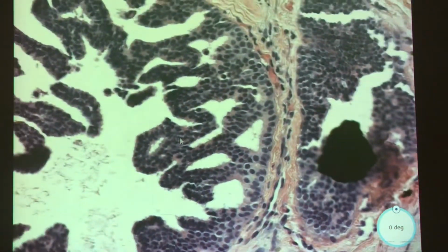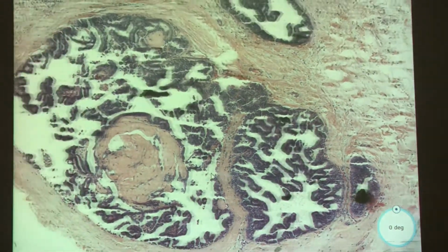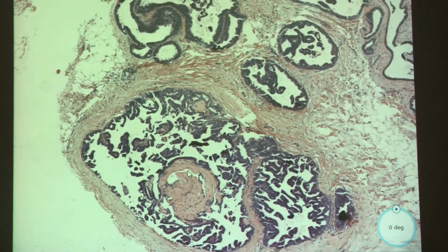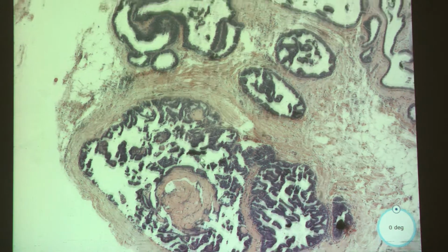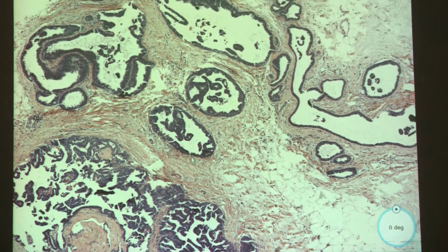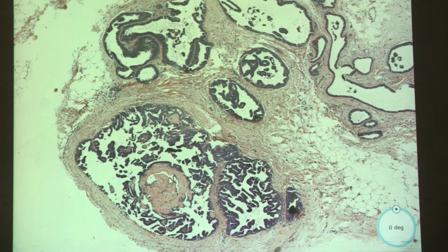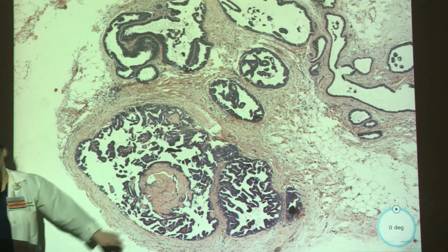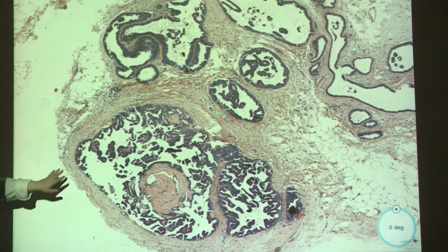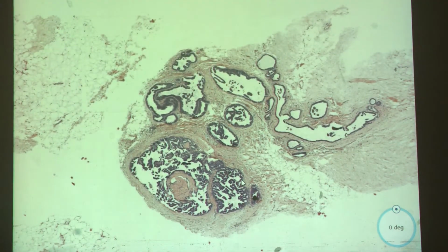Low to intermediate grade. You could hedge a little on the biopsies, as I've learned. And then if you want to go into patterns, I would say predominantly micropapillary this time. There is a bit of papillary, but predominantly it's micropapillary. So, is this involving a papilloma or not? It could. Like this thing. Even if we had papillary DCIS, it's not going to have something like that, big. So that tells you there probably was a papilloma here, and it's just been swallowed up by the DCIS.